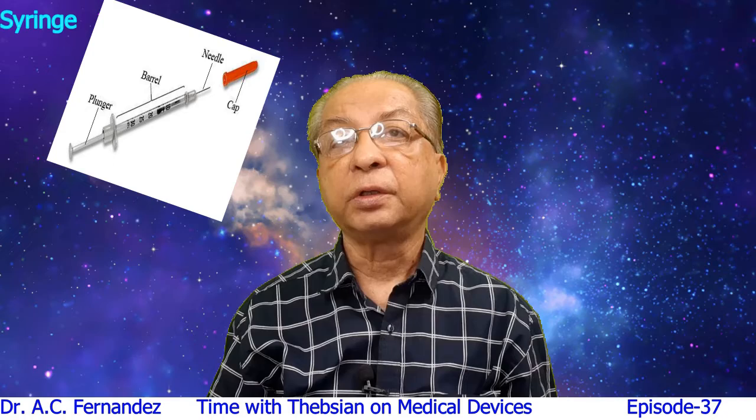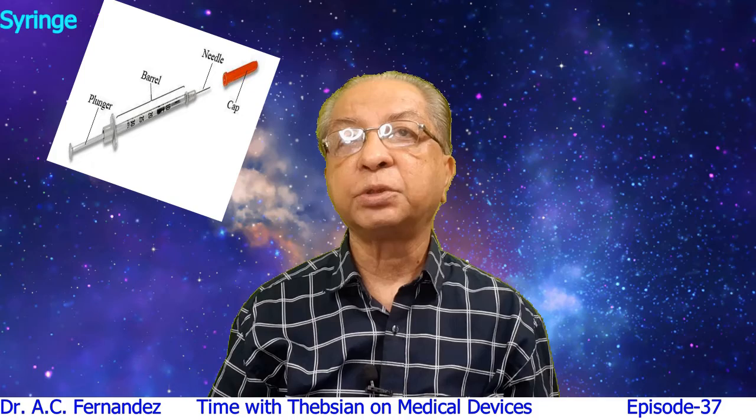Disposable syringes and pharmaceutical materials are not adequately tested for their toxicity and compatibility with tissues. Some studies find that they are not tested. If they are tested and certified for biocompatibility, then there is no problem with using plastic syringes.